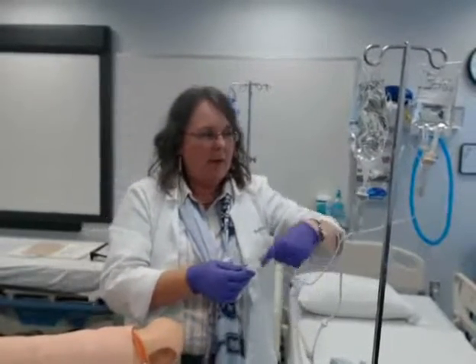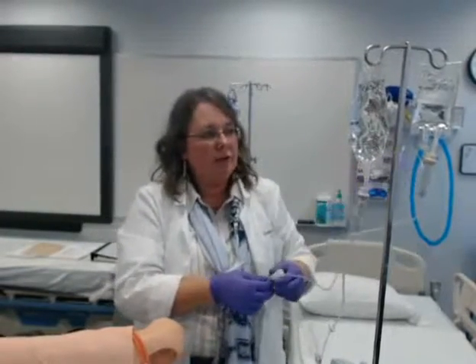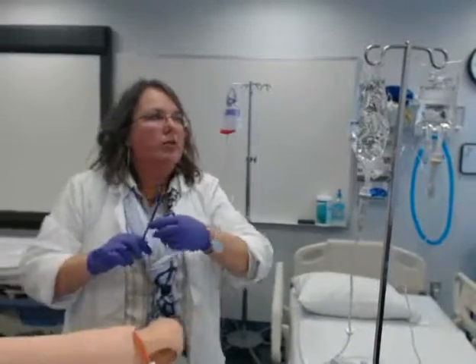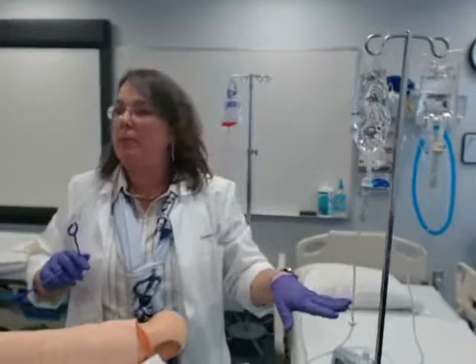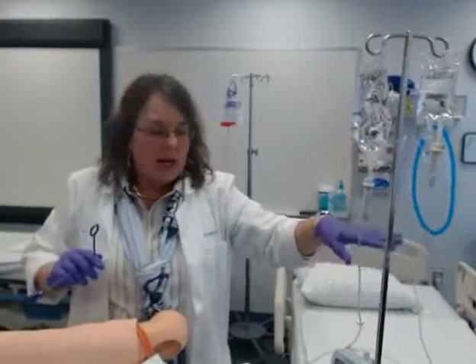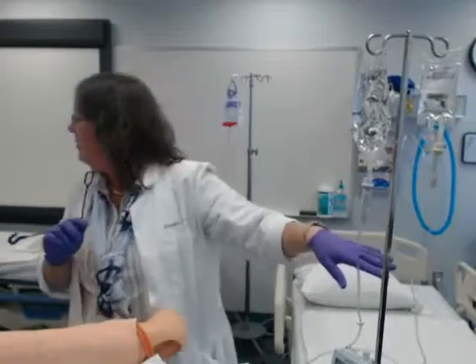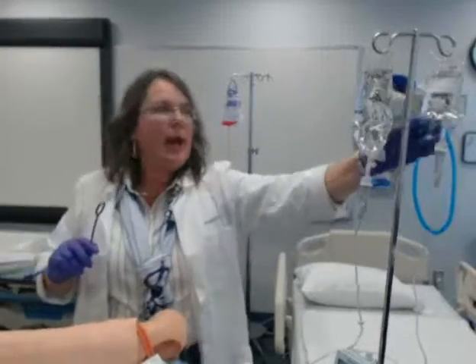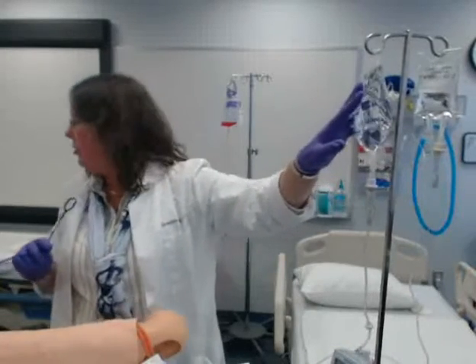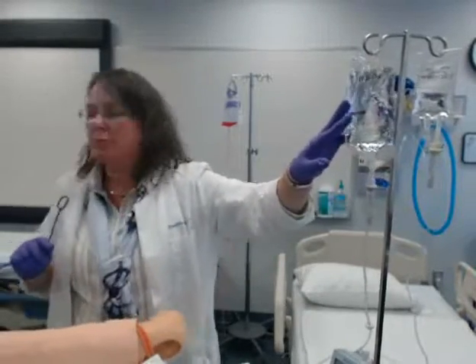My fluid has back primed up to that first or second line. When I put this on my machine, the secondary bag is going to infuse first and I'm going to set the pump rate at 133 milliliters per hour. Then the primary fluid is going to go back to 83 milliliters per hour.